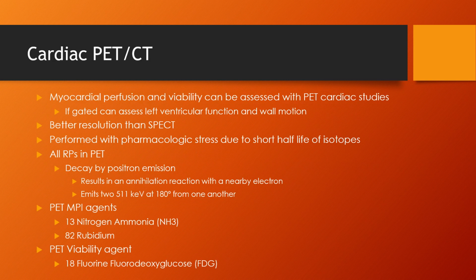Myocardial perfusion and viability can be assessed with PET cardiac studies. If the MPI studies are gated, it can assess the left ventricular function and wall motion. PET MPI has better resolution than SPECT imaging. It's always performed with pharmacologic stress due to the shorter half-life of isotopes.